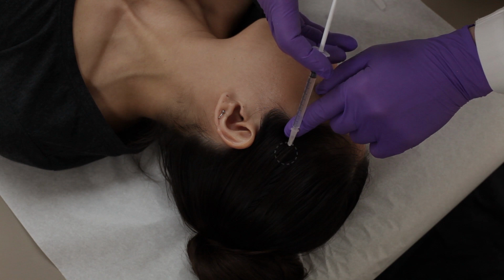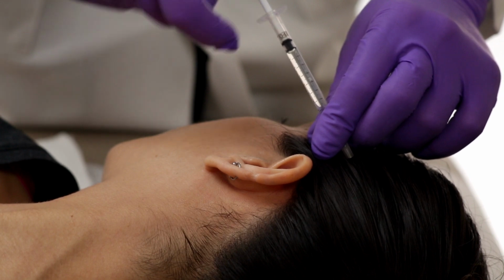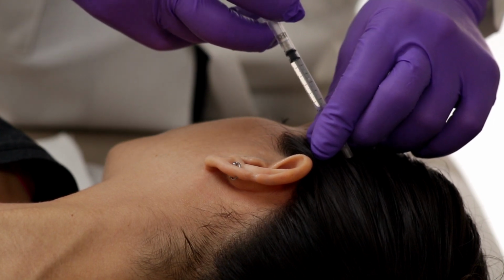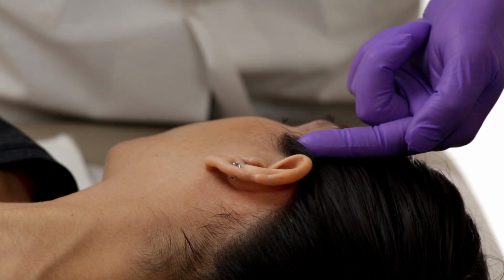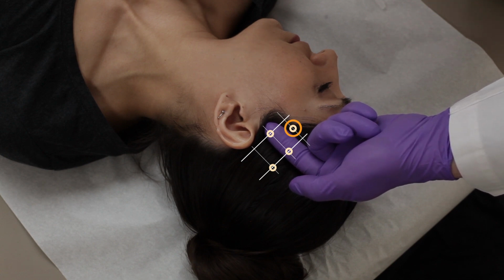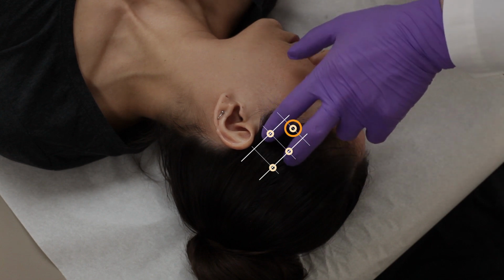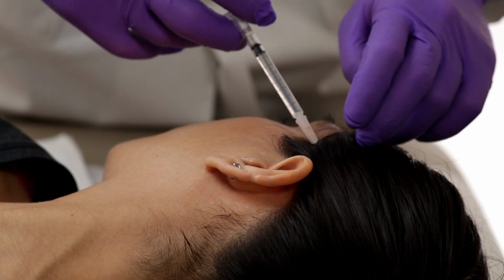Once your finger is approximately in line with the frontalis injections, stop and make the second injection. For the third injection, move forward toward the face, approximately 1.5 to 3 centimeters or 1 to 2 fingers breadth from the first and second injections. Make the third injection halfway between injections 1 and 2 and in line with the corrugator injections.